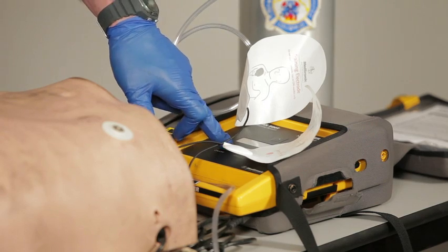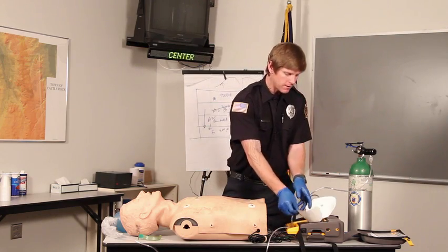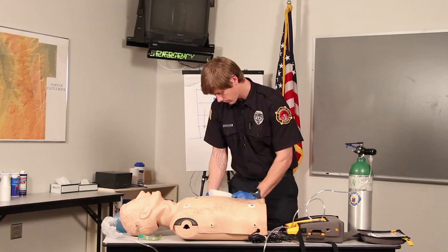As you get your AED out, you'll power it on and it'll tell you to connect the electrodes, and there's pictures on where to put the pads. Connect electrodes.